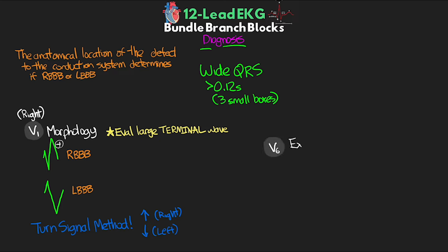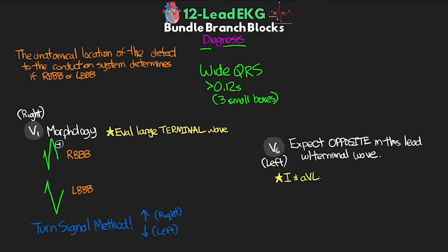From there, we should expect to see the opposite terminal wave in V6, since this lead is on the other side of the heart. Also keep in mind that our lateral leads — leads 1 and AVL — have a very similar direction to V6 and will present with similar morphologies. There are certainly further characteristics used to properly evaluate and diagnose bundle branch blocks, but this goes deeper into 12-leads than is necessary for this basic interpretation series.